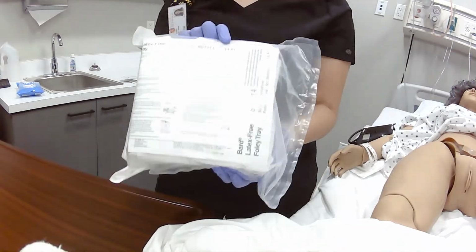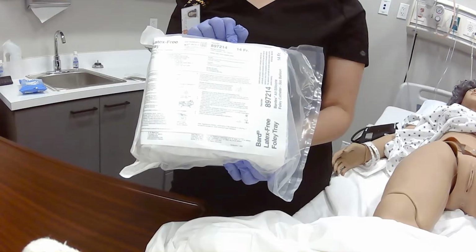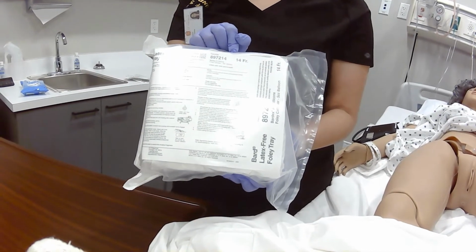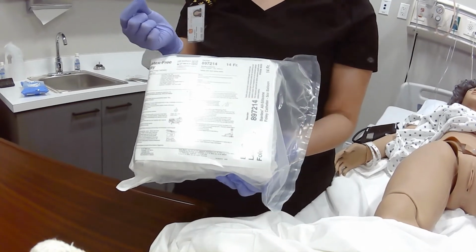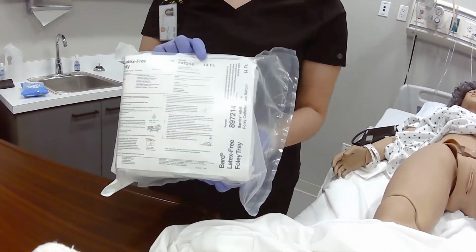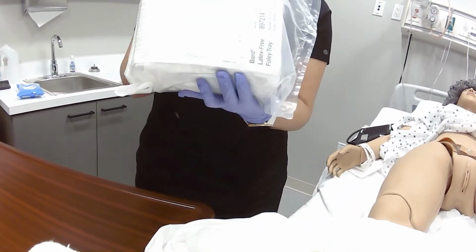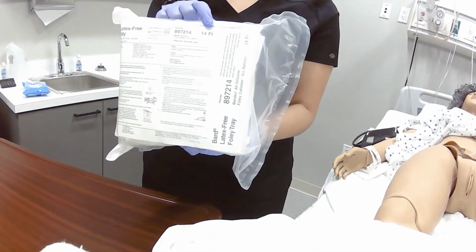With Foley catheters, the higher the number, the bigger the catheter, which is in reversal to the needle sizes. So with needles, the gauge size, the higher the number, the smaller the needle. So remember, with Foley catheters, the higher the number, the bigger, the wider the catheter.